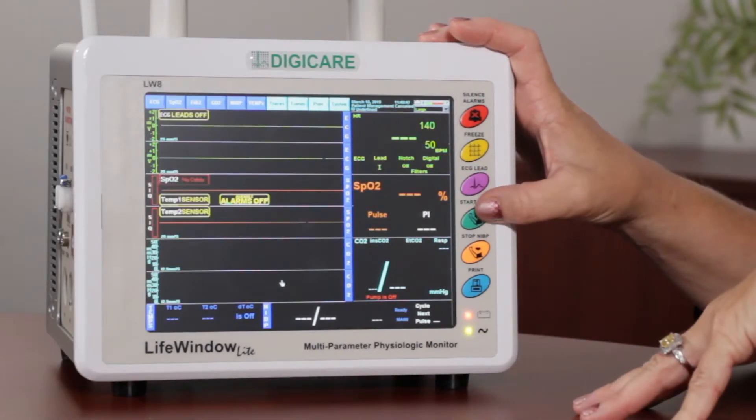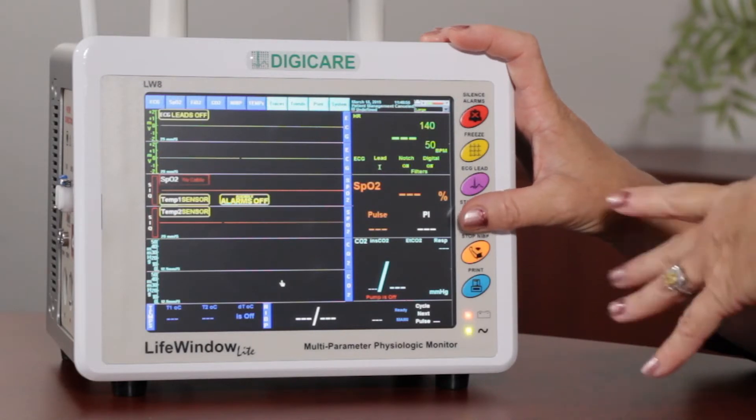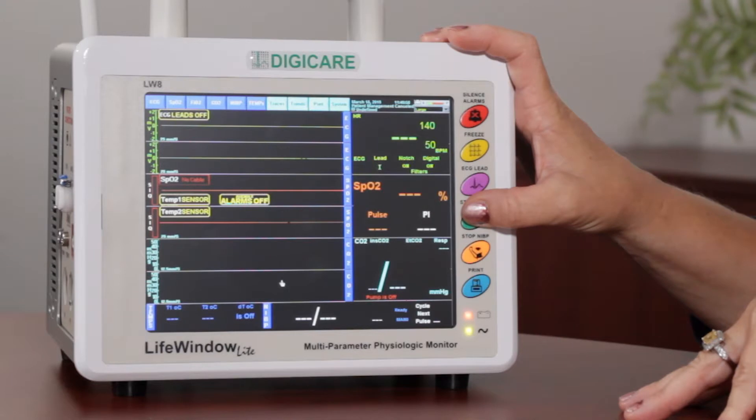Next, we have the Start NIBP button. This can start your blood pressure — this would just be for the manual cycle, so this would allow you to take it into a room and get a quick reading on a patient.